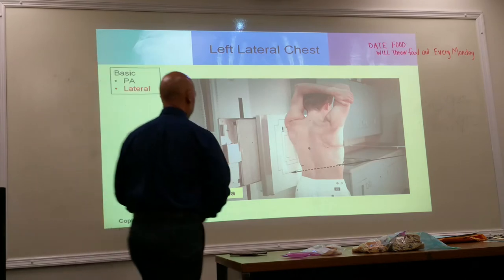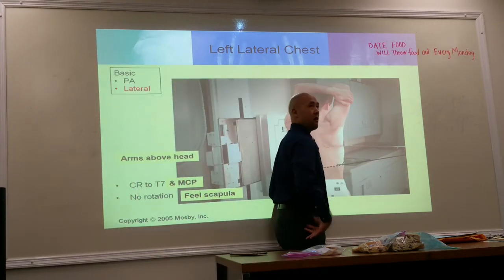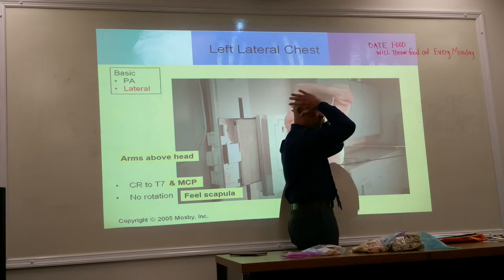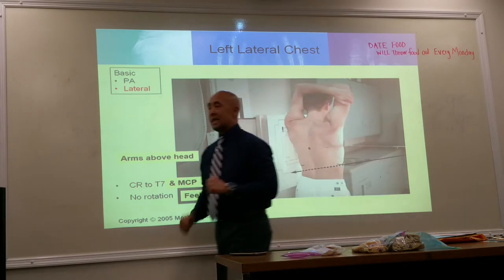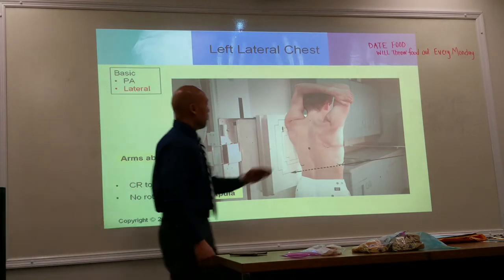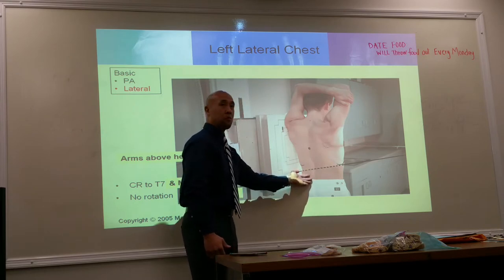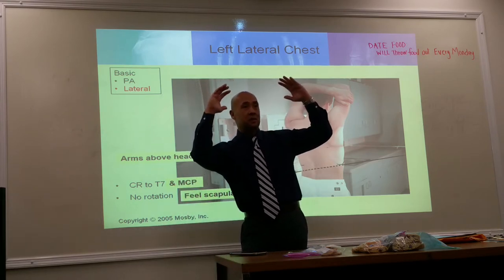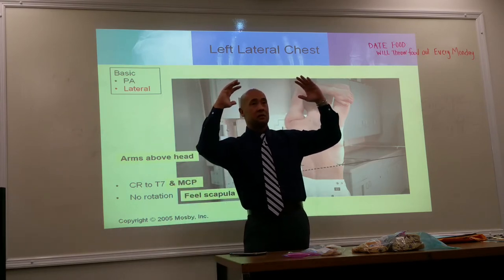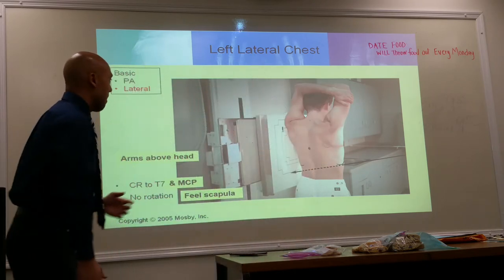Okay, let's talk about the lateral chest x-ray. Lateral chest x-ray from the PA. I'm going to flip them off to the side now. Arms up, out of the way. Get it up. Avoid any tilt. Press their chest up on the board, but don't press their hip up on the board because otherwise they're going to do this. That's going to cause tilt. Make sure they're perpendicular and upright.